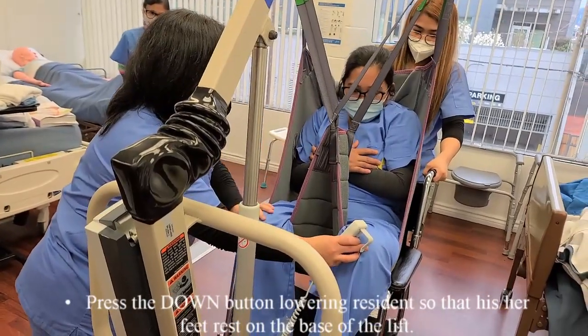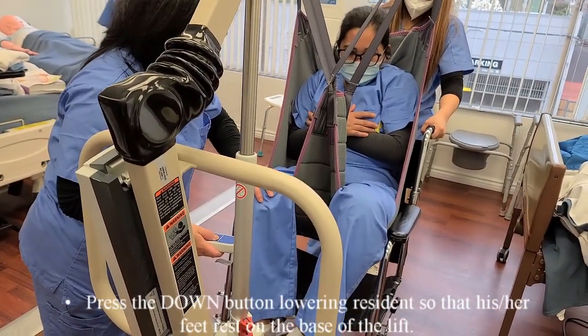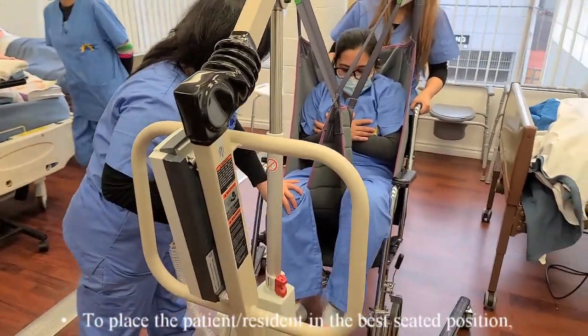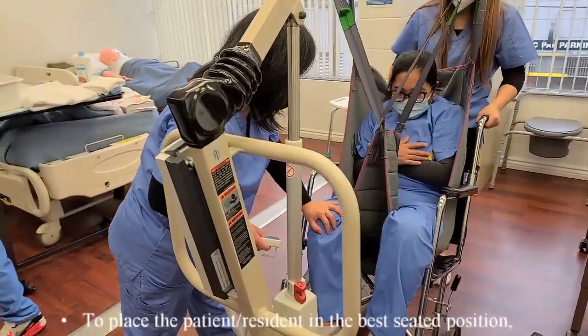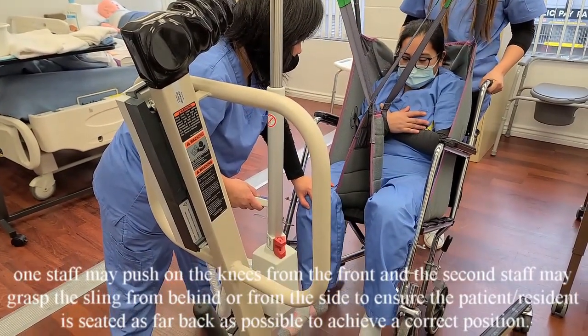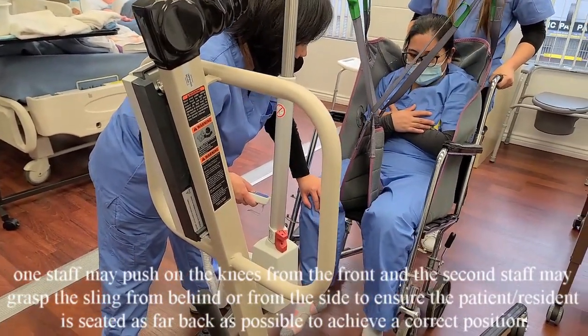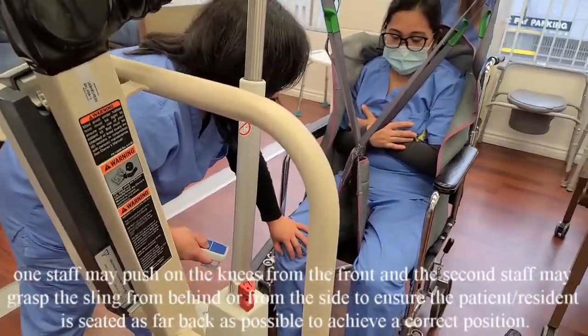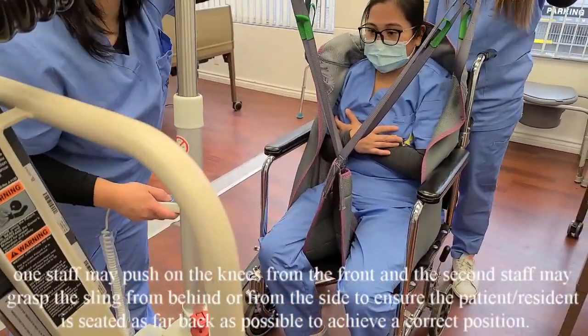Press the down button, lowering the resident so that his or her feet rest on the base of the lift. To place the resident in the best seated position, one staff may push on the knees from the front and the second staff may grasp the sling from behind or from the side to ensure the resident is seated as far back as possible to achieve a correct position.